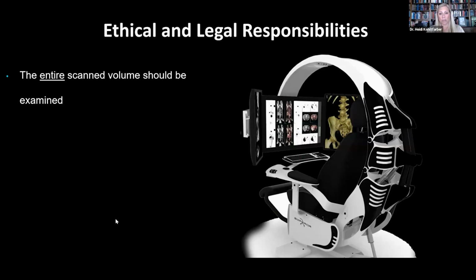You actually have the opportunity to catch things way before your patient has any sort of detriments or issues. So do we see lesions at the cranial base? Yes, we do. And if they calcify, we will see them on our CBCT. And you, as the dentist, will actually catch them first.